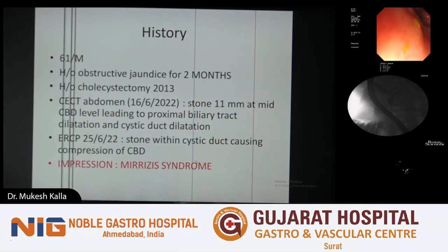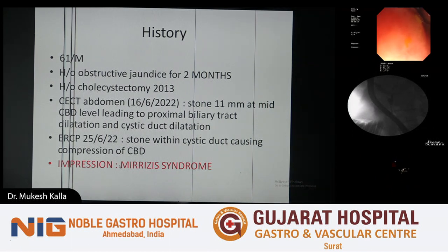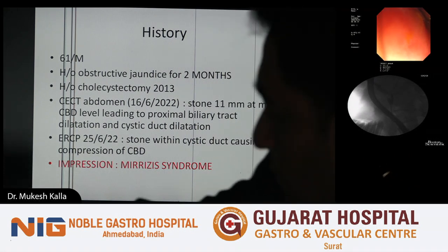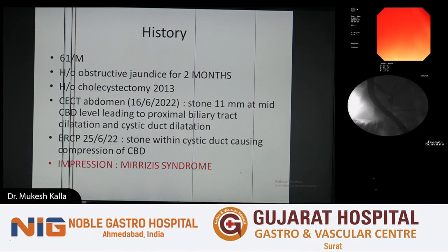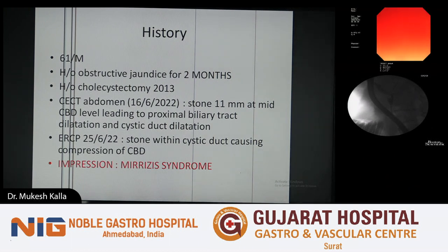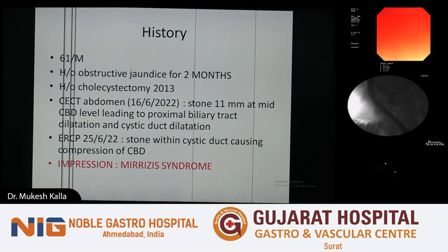This is my approach. I have done this surgery 7 years before. Most of the stones come like that, and I ask my colleague friends, they will say we have removed it. No problem. But for Mirizzi syndrome, for this kind of bigger stone, I feel that they should first attempt endoscopy. If they are not successful, put the biliary stent inside. During the surgery, it will help us a lot and reduce the morbidity. So it should be a joint approach rather than a verdict that you should always do these things. I feel strongly: if the first attempt fails, you always have the option of lap CBD exploration. That is my point.